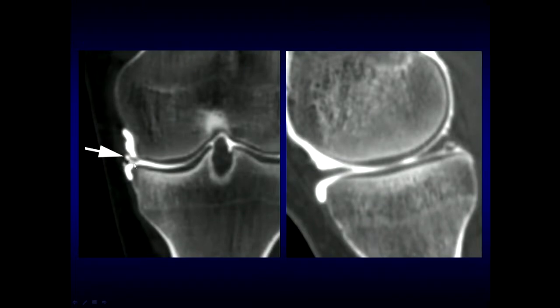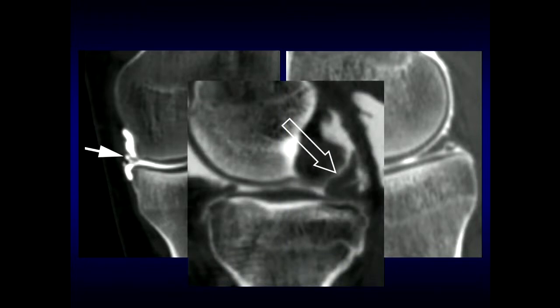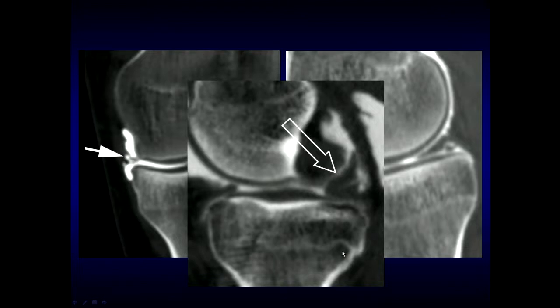CT arthrography examples: a horizontal cleft within the body of the medial meniscus following partial meniscectomy representing a recurrent tear; another patient showing a recurrent or residual tear of the undersurface of the posterior horn of the medial meniscus with contrast extending into the meniscus substance on sagittal reconstructions; and yet another patient with a large displaced flap tear of meniscal tissue in the region of the intercondylar notch, arising from the posterior horn of the medial meniscus — a recurrent unstable tear.